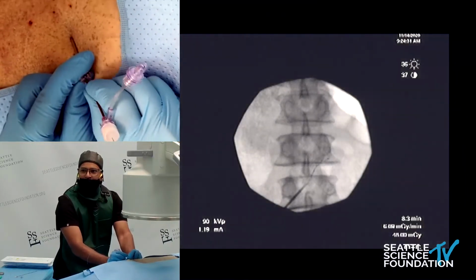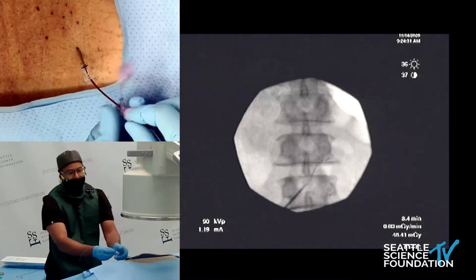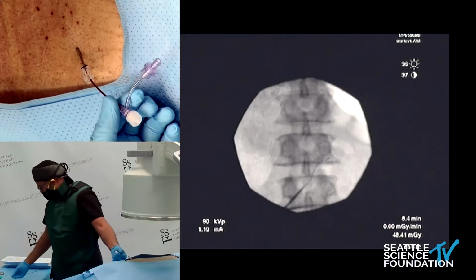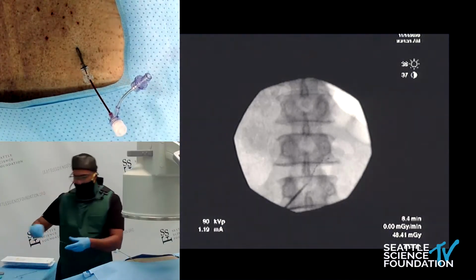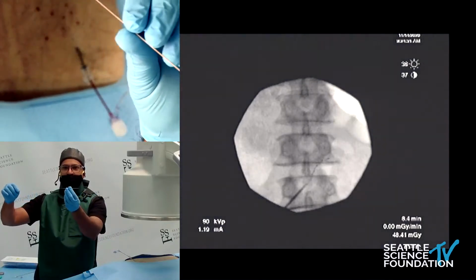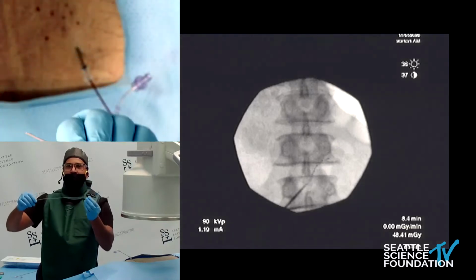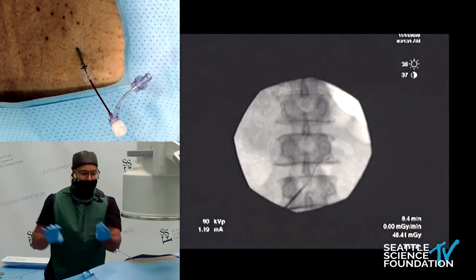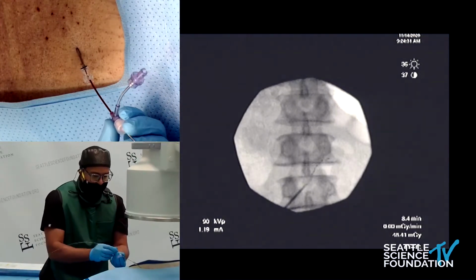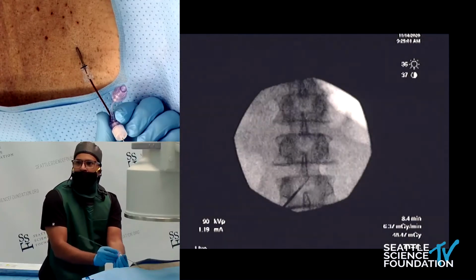Now, another option, in case you're like, well, gee, this is taking too long, is I can take the lead out, and I can put in a guide wire. And this will also come in your kit. I don't know if you want to zoom in on this. Perfect, beautiful. I don't know which camera. There we go. You can see there, it's a nice, firm, rigid guide wire, able to place that through the sheath. And you can see under fluoro what that looks like.